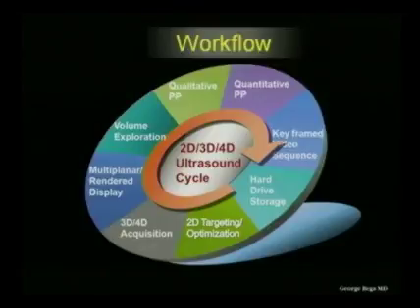Then we may do a number of either qualitative or quantitative post-processing steps. A qualitative would be pretty much either displaying the surface anatomy or the inside anatomy, bony tissue or fluid-filled structures. And quantitative analysis will pretty much go around the volume measurements.